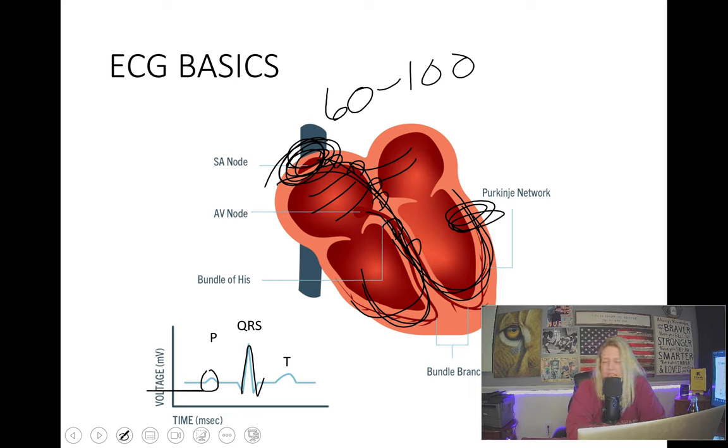So what are these? I'm going to talk about these in a different video, but just to let you know, these are premature ventricular contractions. They're PVCs, premature ventricular contractions, but I'll talk about those in another lecture.